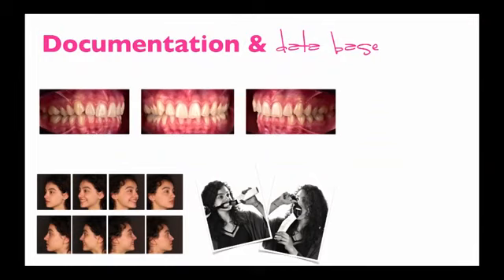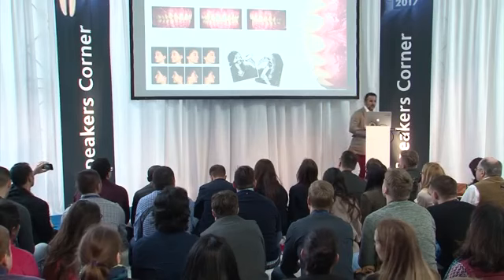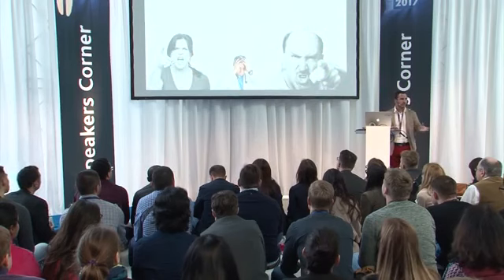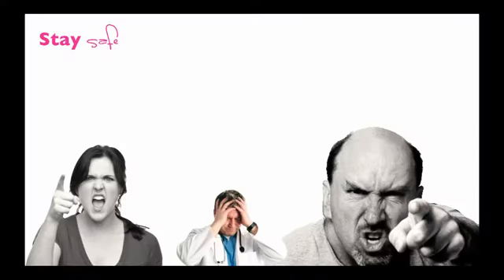Documentation and database for intraoral photography. Usually, if we are receiving a new patient, you can make a full set of photos before, during the treatment, and after the treatment. And I will try to talk a little bit about this later. Why we need dental photography is also because we have different types of patients. Some of them are okay to work with, but some of them are very difficult. And then it's very good to have this documentation well done, what I told you before, during, and after the treatment, so you can have proofs of your work.